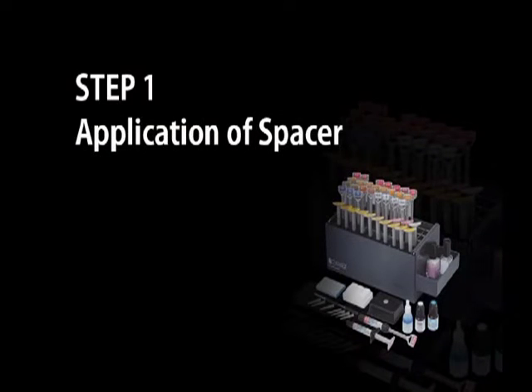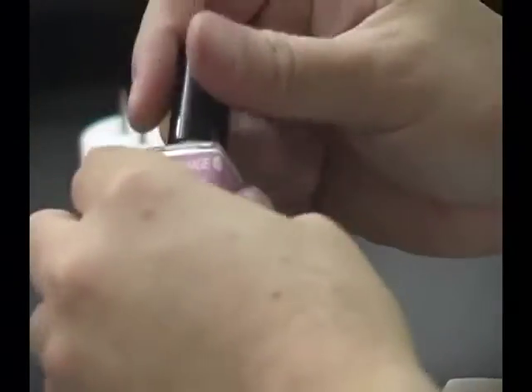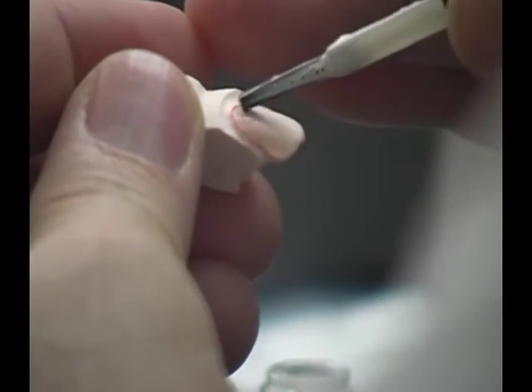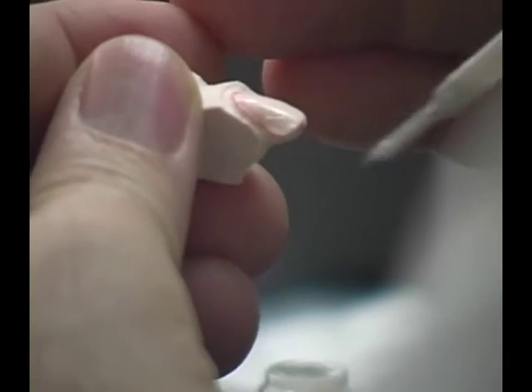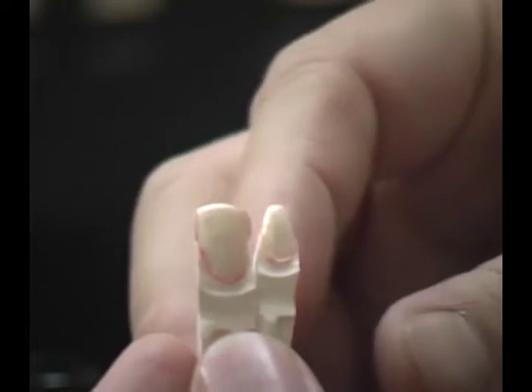Application of spacer. Take the Ceramatch spacer and shake the bottle to ensure uniform consistency. Apply the spacer in a thin, even layer and let it dry. This step is important to achieve adequate space for the resin cement during final placement of the restoration. When fully dry, the color will change from milky white to transparent and you can proceed with the next step.